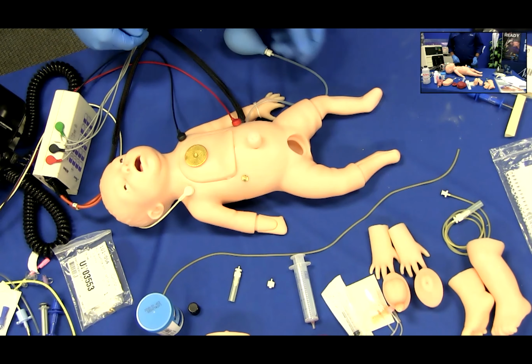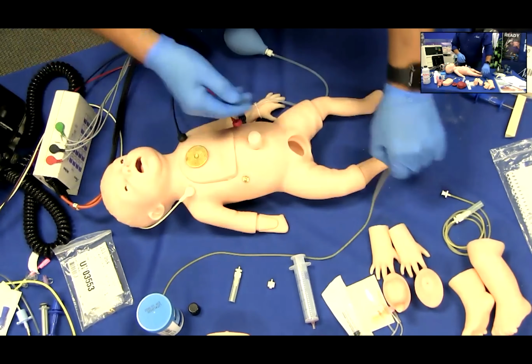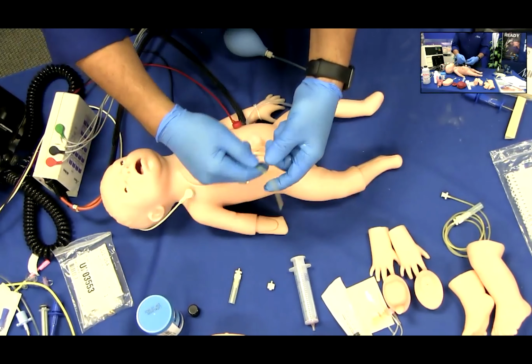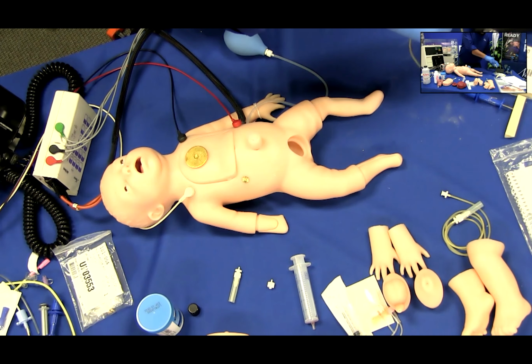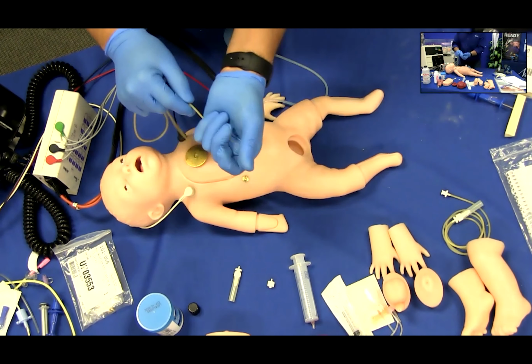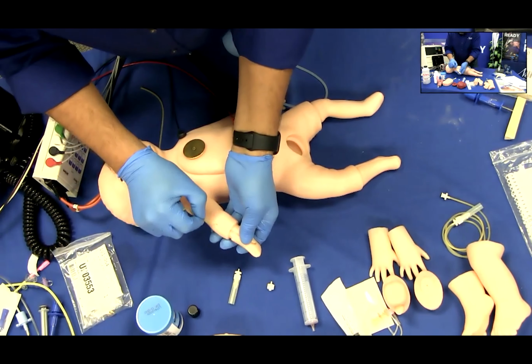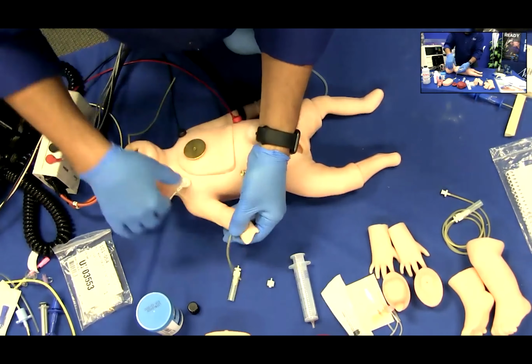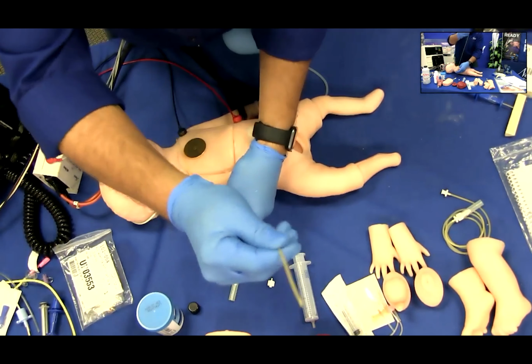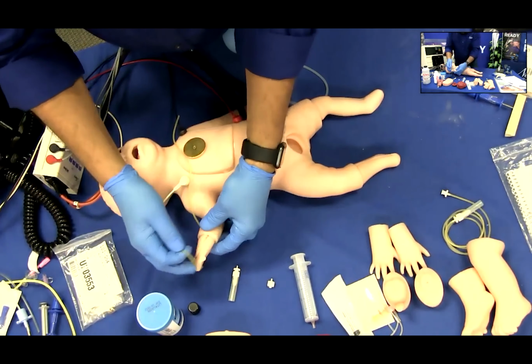Moving on to the IV hand and foot. Dip the non-fitting end of the vein tubing into the provided lubricant. Feed the tubing through the lateral hole just above the hand. Form a loop over the vein channel. The loop should be approximately in the middle of the vein tubing section.